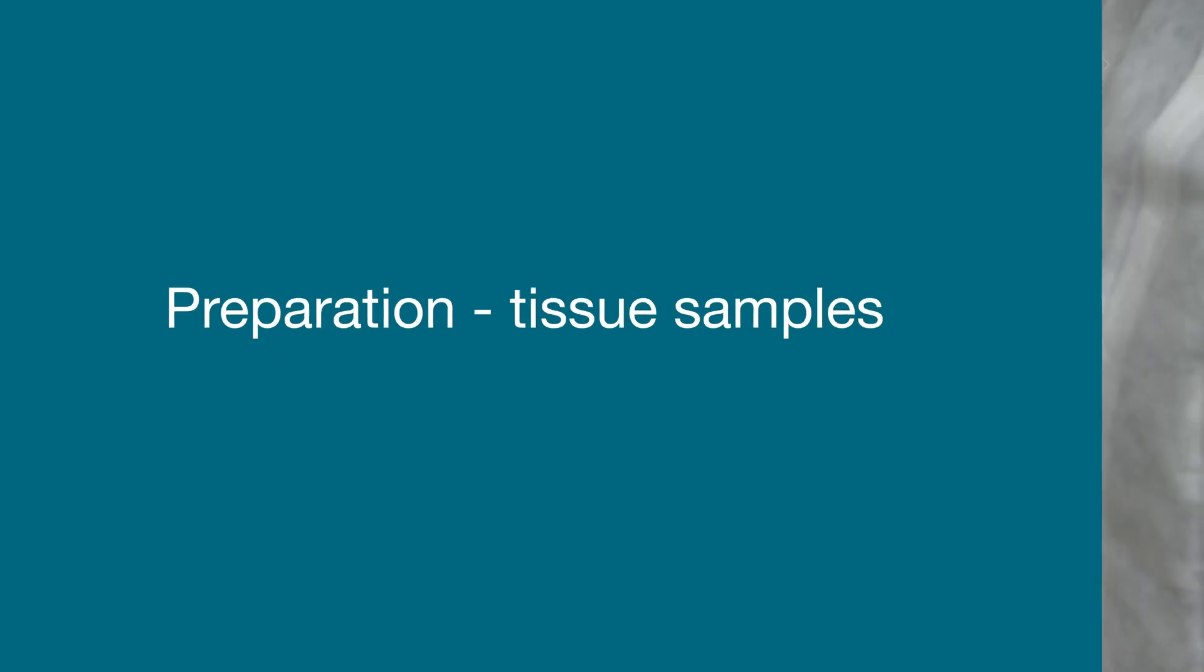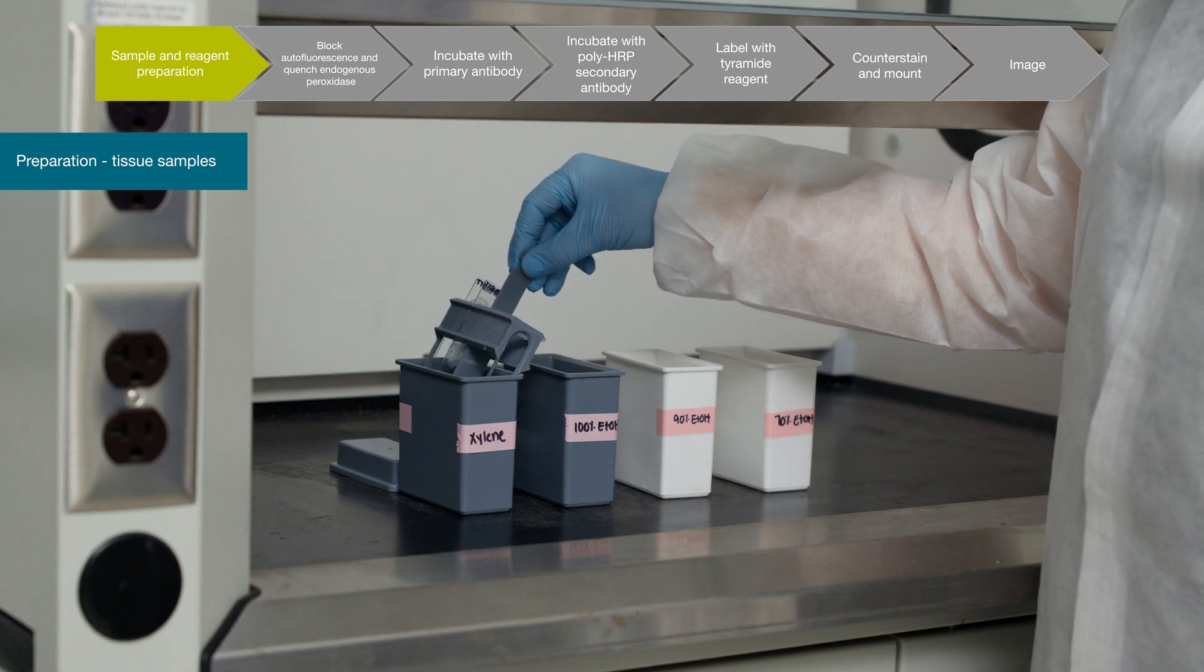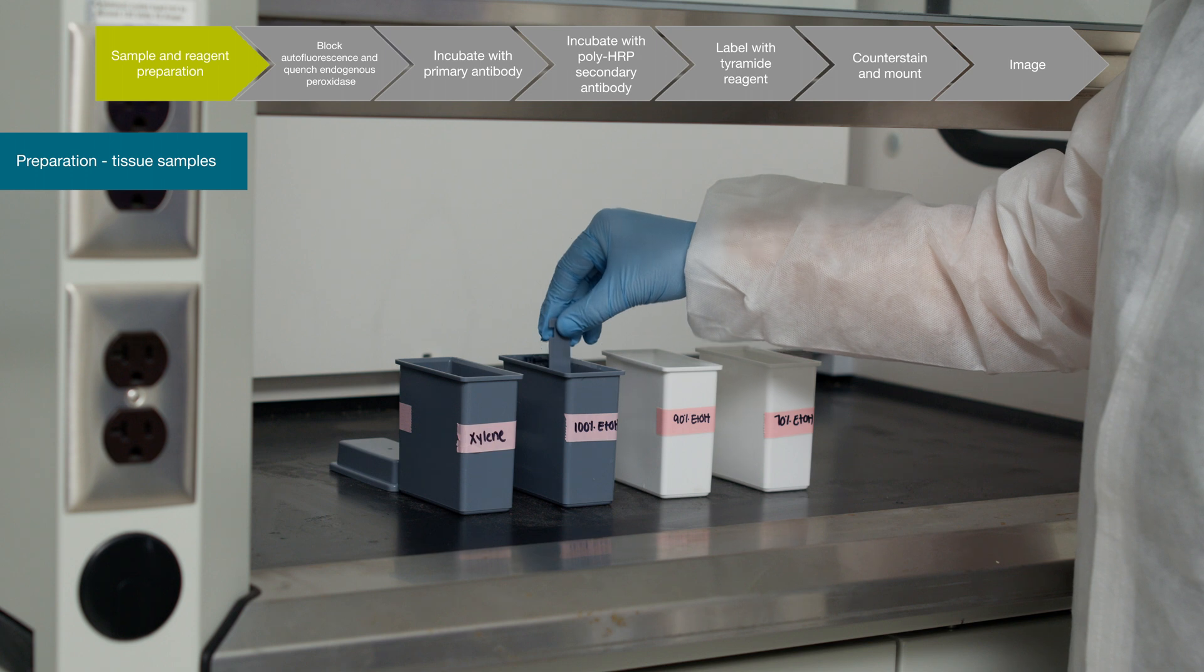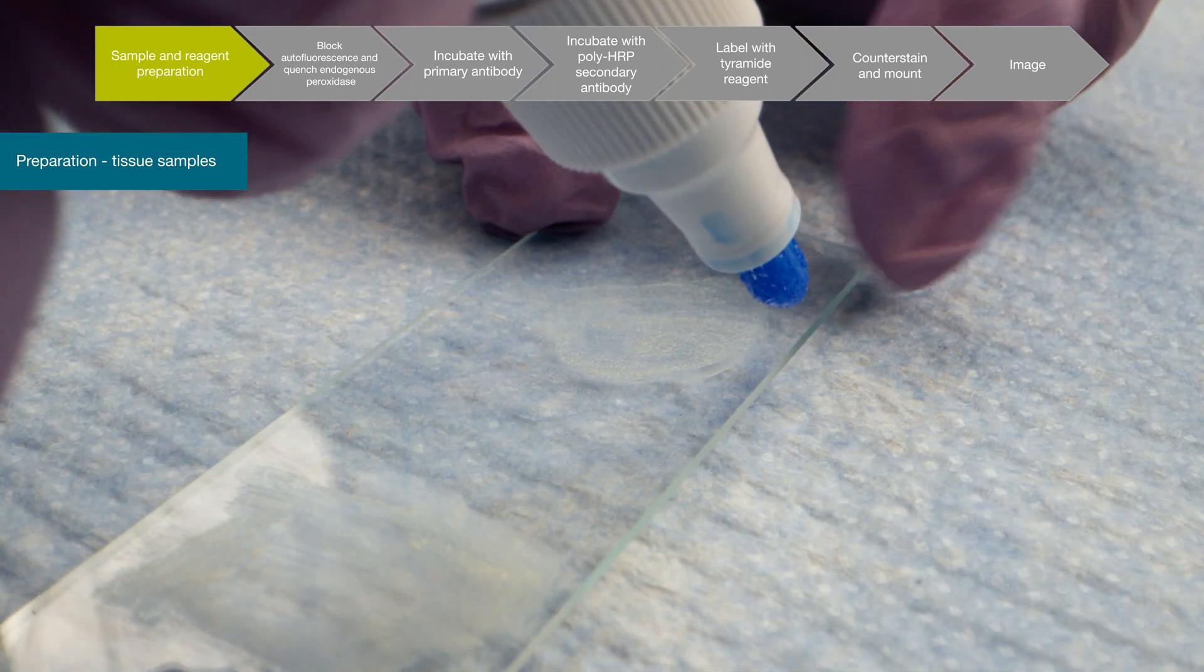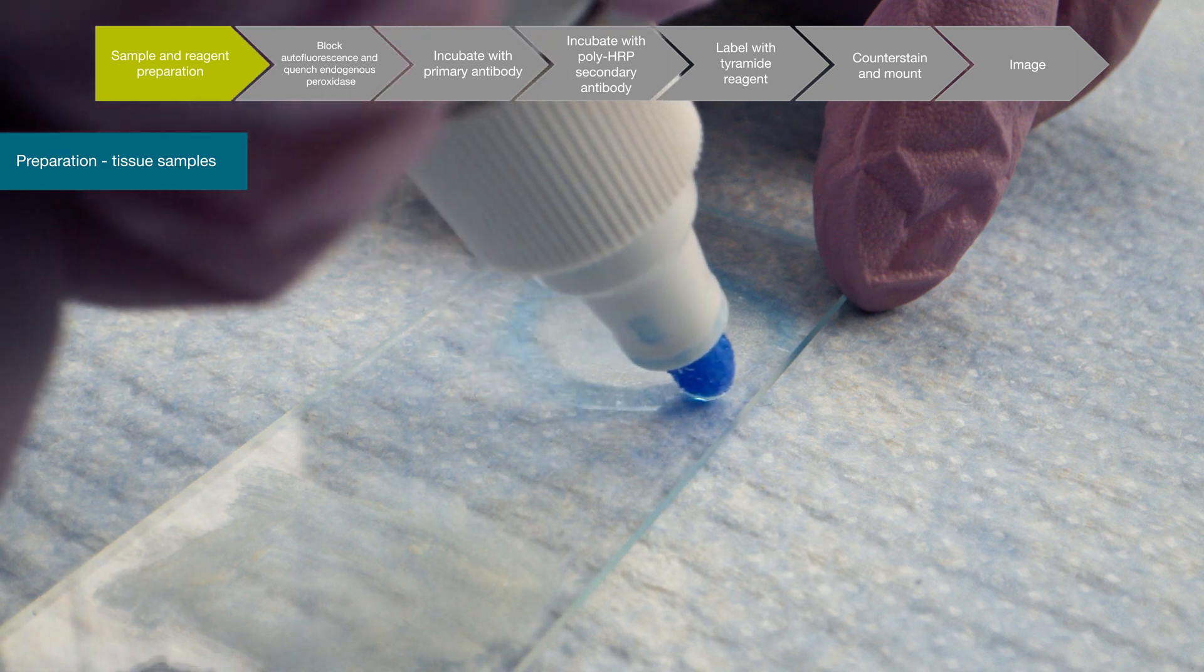Prepare your tissue sample. If working with a FFPE tissue sample, deparaffinize and rehydrate the sliced tissue sample. Afterwards, perform heat-induced epitope retrieval. Use a hydrophobic barrier pen to draw a circle around the sample and allow to dry.